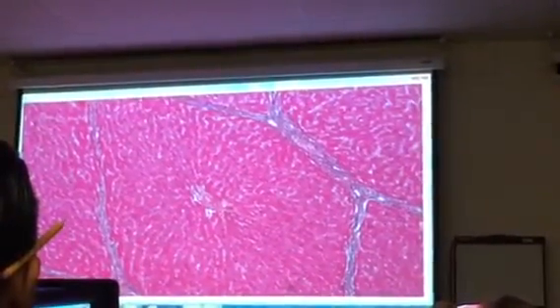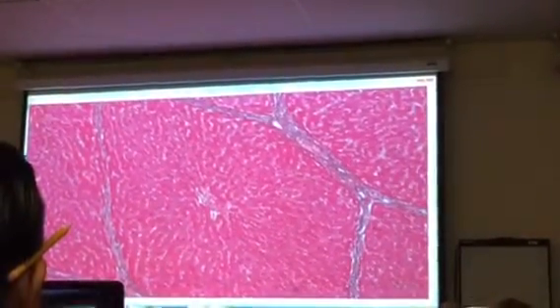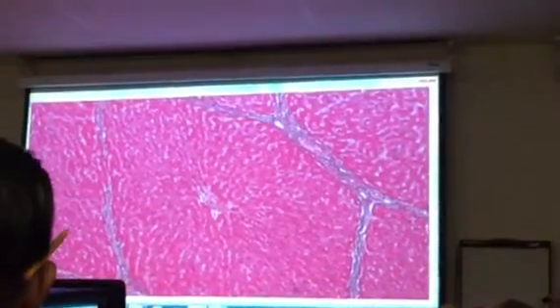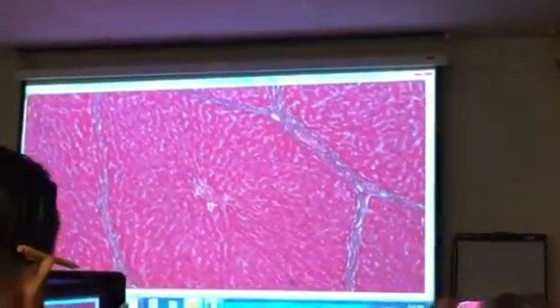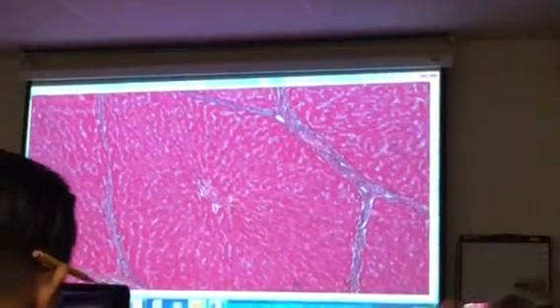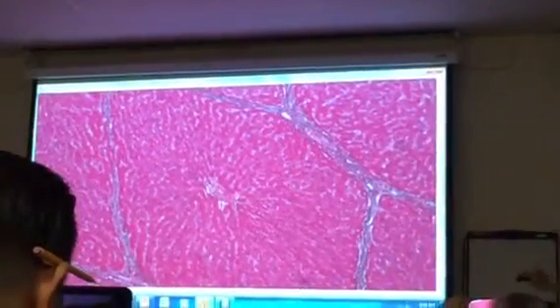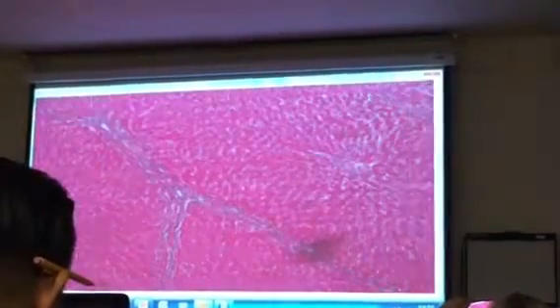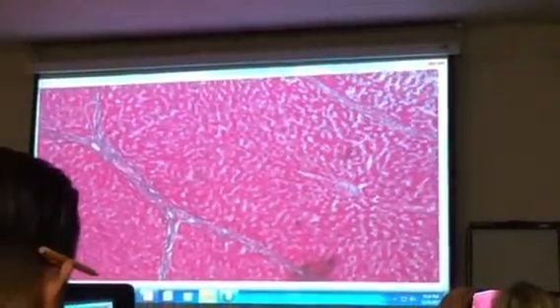Okay. So the liver is organized into lobules. This is sort of like bone, where we saw osteons. Okay, so the liver lobule is this sort of geometrical shape, usually looks like a hexagon or a pentagon. Okay, and the liver has a bunch of these. So if you move around, you should be able to see another one.